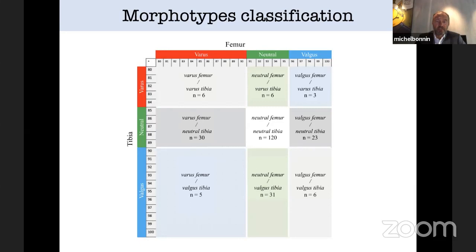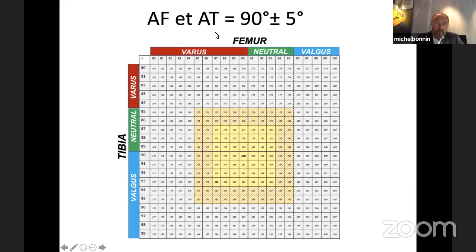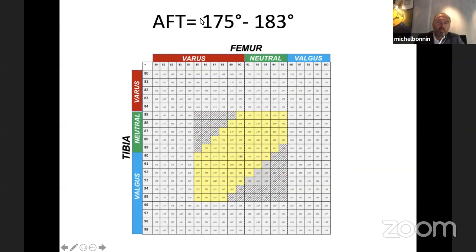And if you look at our strategy, you see what we can do with the custom prosthesis, is that if you look at the orientation of the bone cut, it's plus minus 3 degrees. So it's the yellow area. And then we have 2 degrees more possible with the inclination of the implant itself, which is the orange area here. And third rule, we want to have no more than 5 degrees global varus, no more than 3 degrees global valgus. So in yellow here, this is our target zone. It is what we call the safe zone.